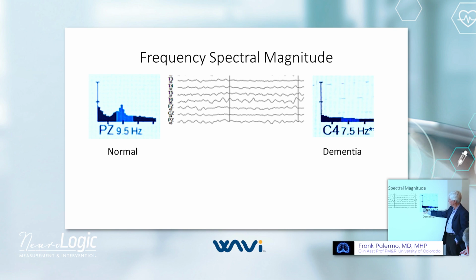So this would be like 0.5, 1, 1.5, 2, and then all of a sudden you get into this blue area, and the blue area is called the alpha spectrum. Each one of these little hash marks down here, that's 5, 10, 15.